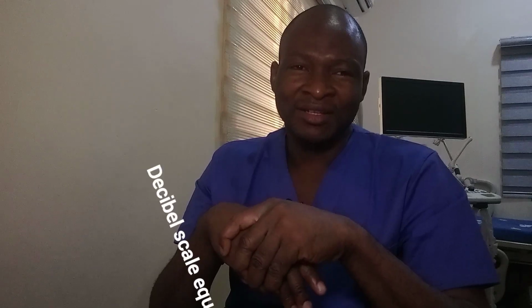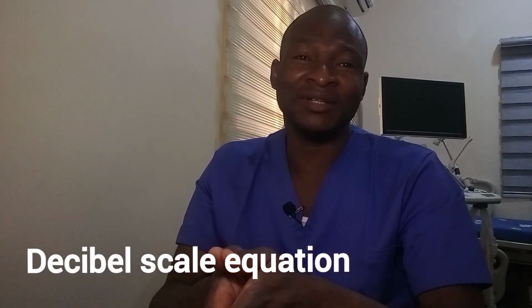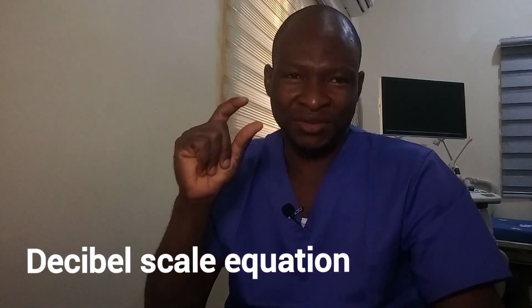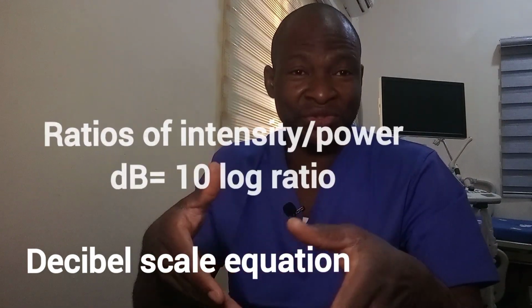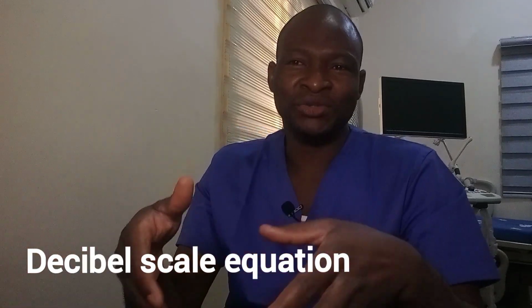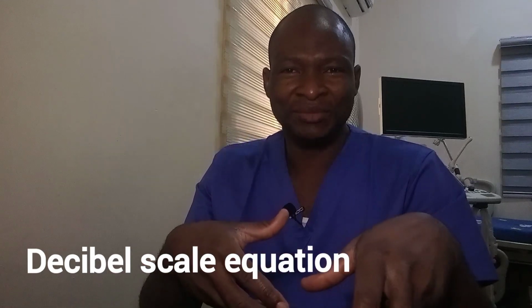The decibel scale equation. To use the decibel scale, we need to know the decibel equation. There are two decibel equations that we need to know. One is used to deal with ratios of intensity or ratios of power. The other is used to deal with ratios of amplitude or ratios of voltage.